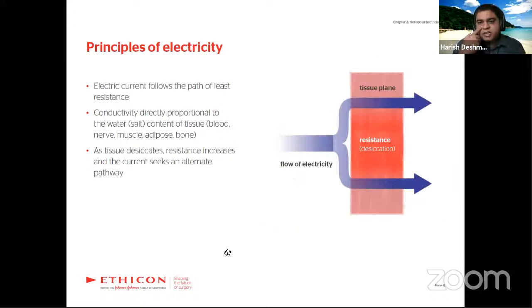So we spoke about electricity passing through the least resistance path. It is just like a herd of cows passing along a road. If you see a car standing in front of those cows, the herd will automatically move towards the side of it and start walking around.